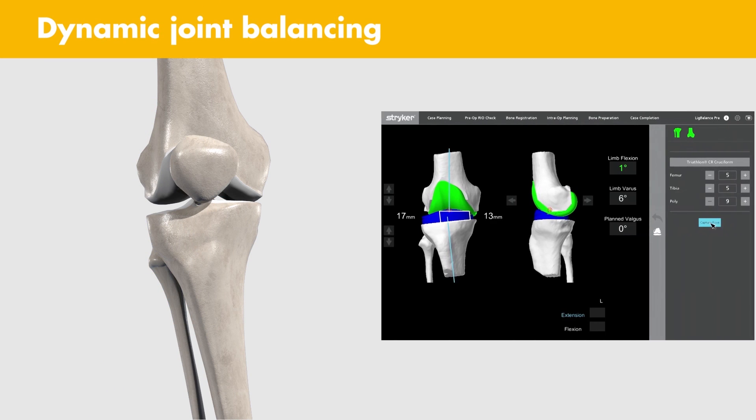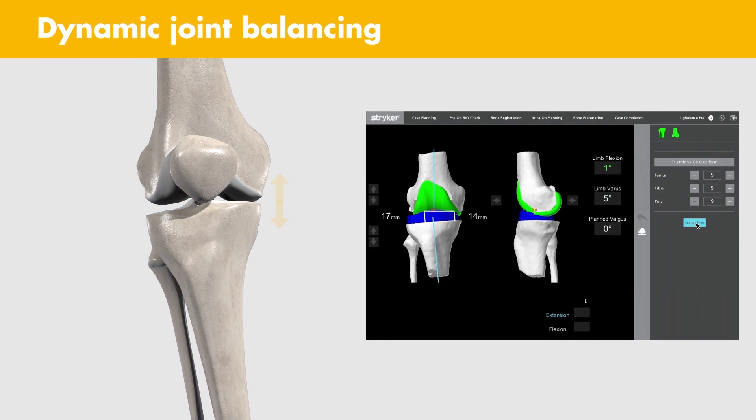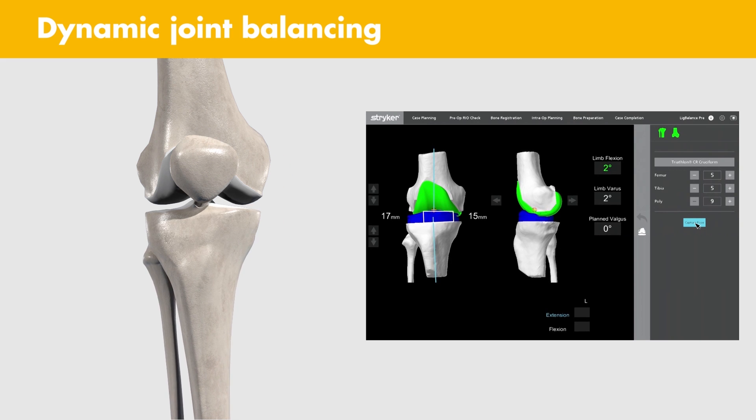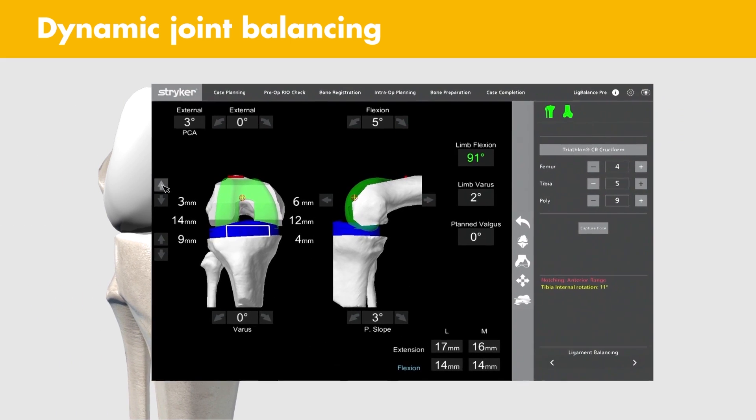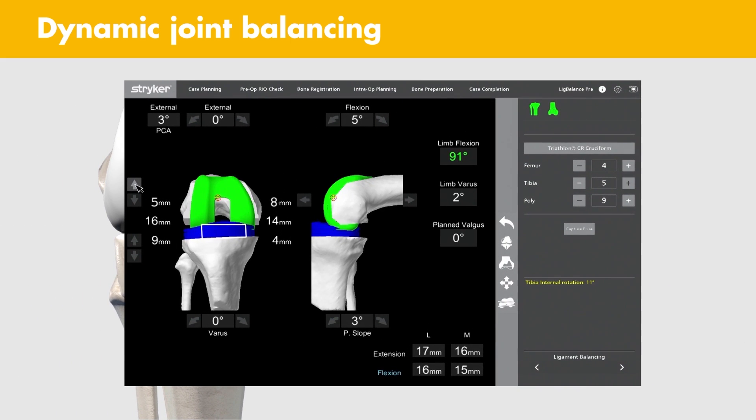Dynamic joint balancing: MAKO provides you flexibility to modify the pre-op plan. After completing a kinematic assessment of the joint, you can perform intraoperative adjustments to optimize implant placement.